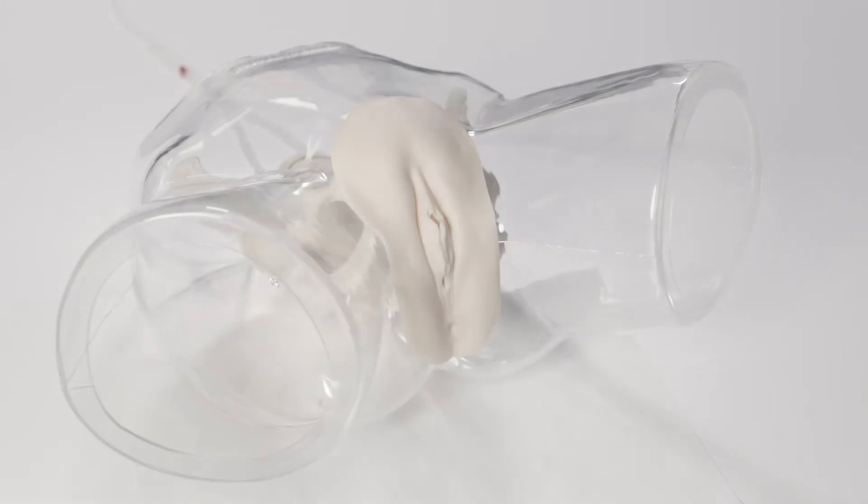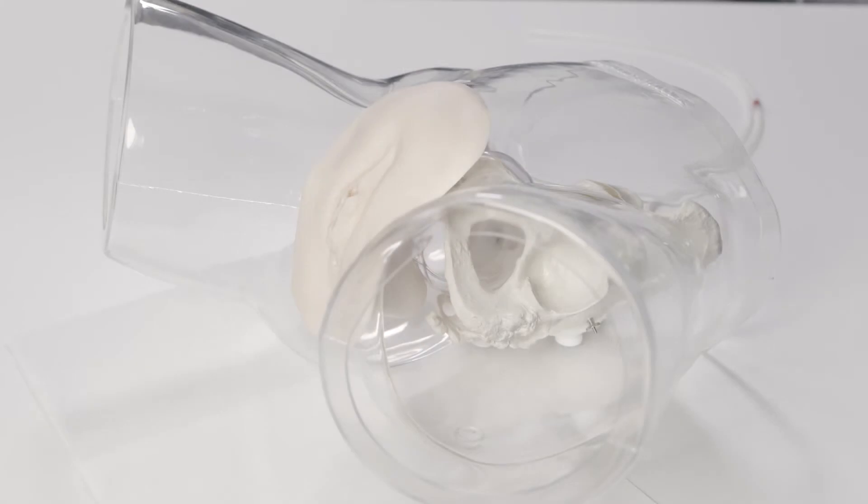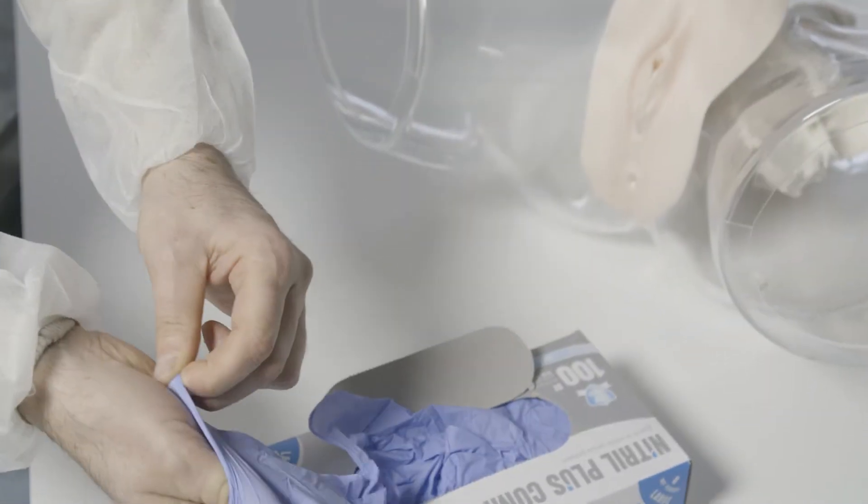This artificial anatomical model closely resembles the morphological characteristics of the female anatomy. Now I start the procedure.